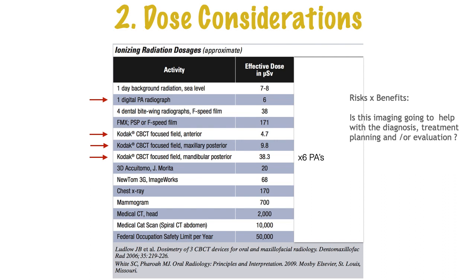The other thing about those considerations, and again, this is an older table from 2009, is that patients may be concerned about radiation exposure. Some patients may be very hesitant to have a CBCT scan taken because they are thinking about radiation exposure.